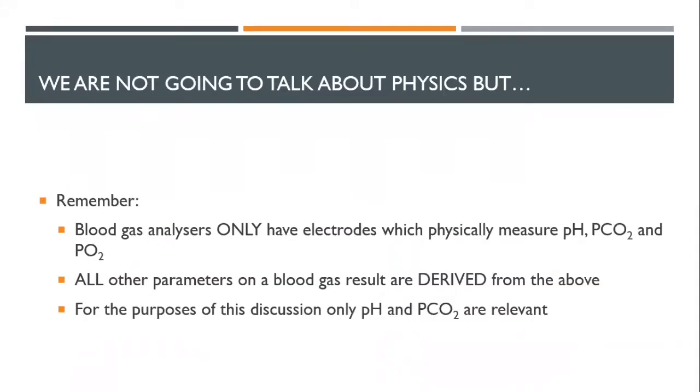So I'm not going to talk about physics. That's very much the anesthesia side of things, and we're not going to go into the physics of how a blood gas analyzer works. It's very complicated. But what's important to remember, and I'm only talking about the acid-base side of things.